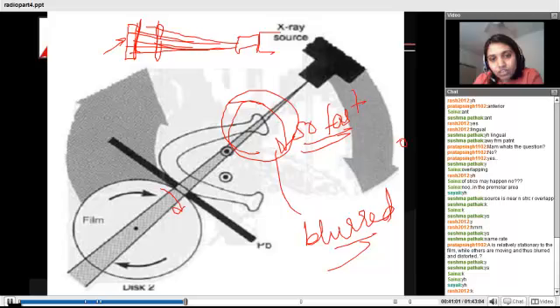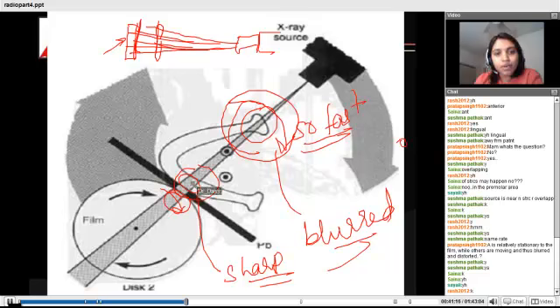And this particular zone where the X-ray is passing with the same speed as the image receptor gets sharp. So actually we record both this point and this point, but this particular zone is so blurred that it does not interfere with the visualization of this particular zone. Getting the point?